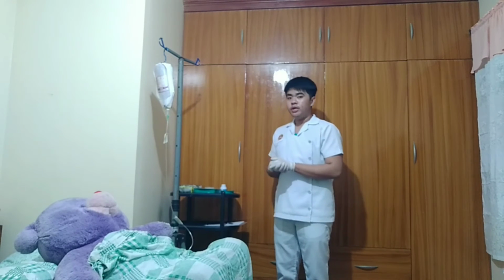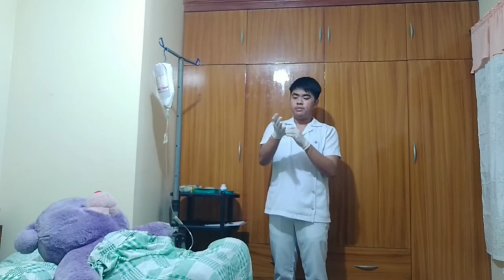So we're now going to discard all the disposable equipment that we have used in the proper receptacles, and we're going to clean the blood if there's any spill on the linen or anywhere. And then we're now going to remove our gloves and document our findings in the client's record. And if there's any variation from normal findings, we're going to report it immediately to the client's physician. And after removing the gloves, make sure that we perform hand hygiene.